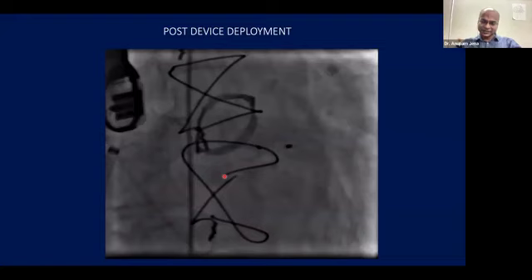Yeah, exactly. So, I mean, there is not much literature to review also. And the case reports I find, I think there are 4 or 5 case reports that I could find, and all of them have used it. Just last month I've done a tricuspid valve perforation, which is a surgical turn down, that we have closed with a Konar device. And I've closed one mitral valve with a Konar device, but that was 2.5 years ago. That patient is still all right. I have told that in case the leak becomes more, we'll send you for surgery. But that was more palliative because it was a surgical turn down. So I said, okay, we'll try.